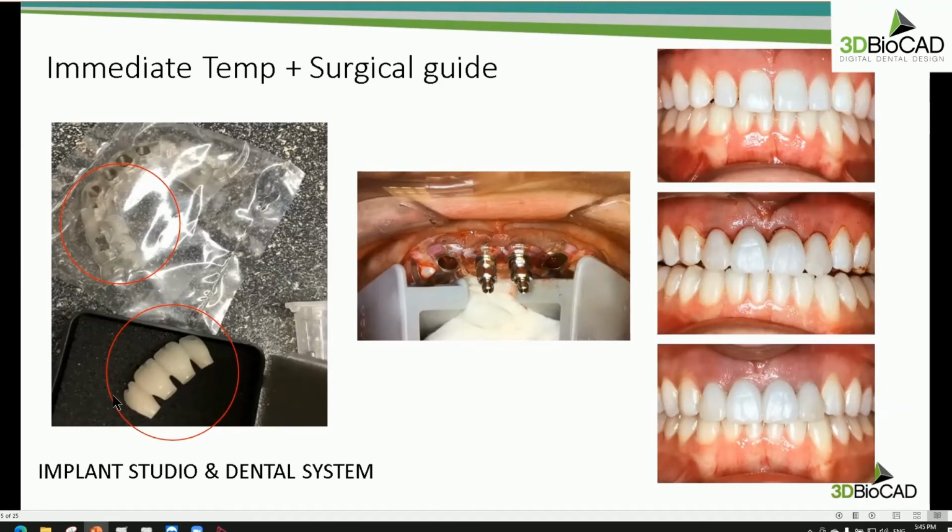So if you see on my photo, the left one here, I did make surgical guide with my doctor, and also at the time I did design and mill screw retain shape of PMMA bridge. So doctor did use surgical guide first and use this milled PMMA, which is high polished, and then doctor use temp cylinder and do the just like minimal relining work.